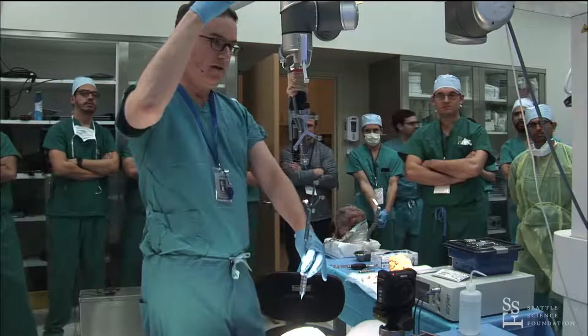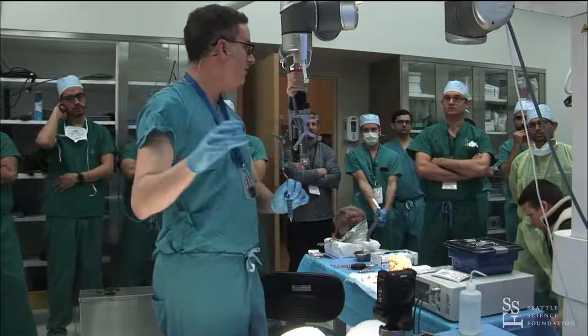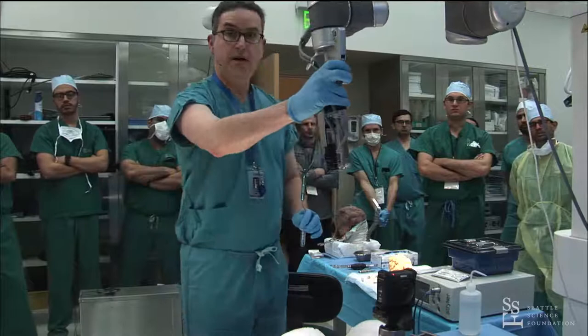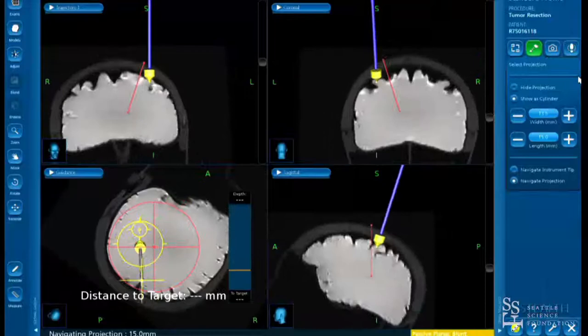In the operating room, we'll turn the bed by 20 degrees off angle so we're looking a comfortable direction as we work without the exoscope in the way. Going back to navigation, most systems will have a guidance view, similar to what you'd use for a needle biopsy, which allows you to align both your position and your angle.